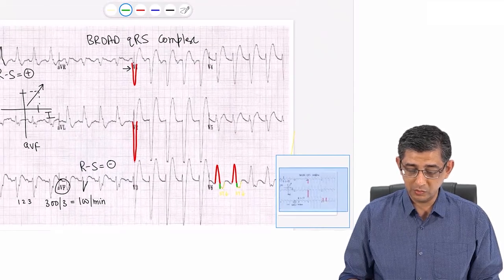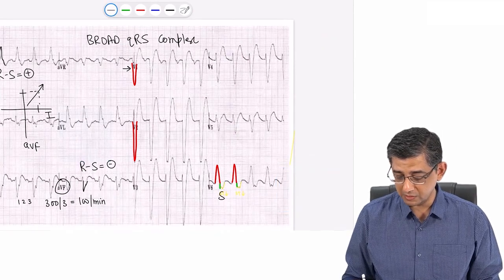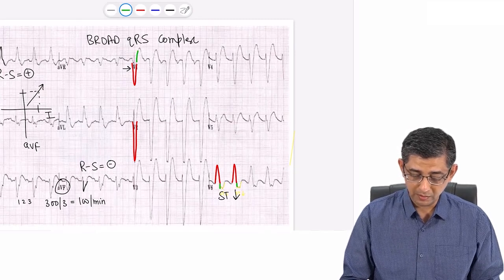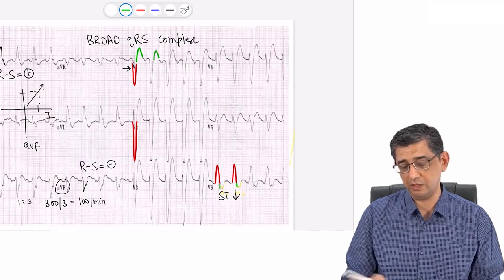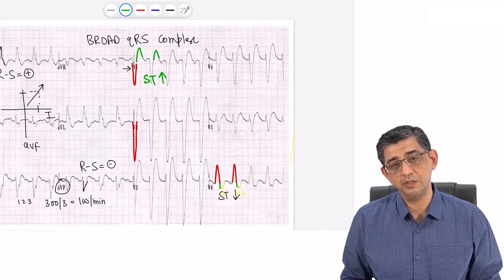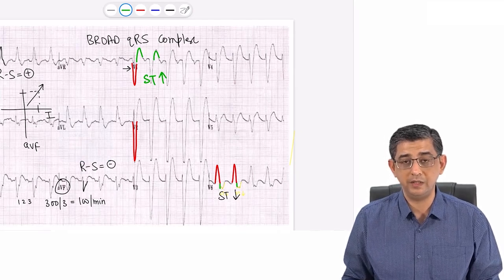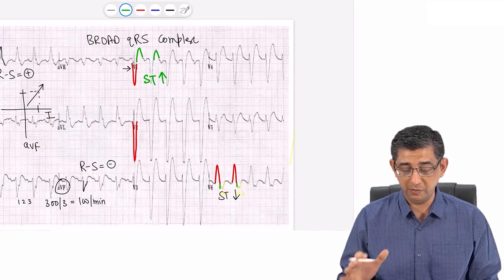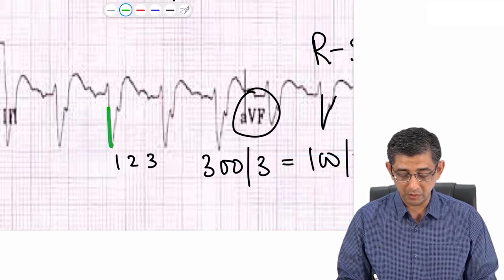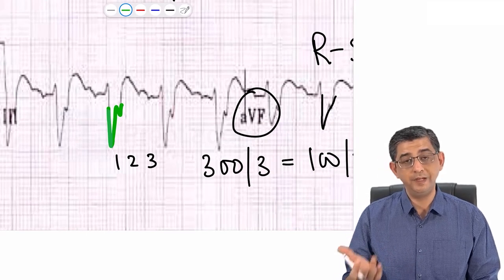I've already sensitized you to this fact and would like to repeat it: this is the ECG where you can have ST depression and ST elevation both present, merging with the T wave anyway. And even if you forget about this, I have shown this ECG mainly to highlight that the M pattern or rabbit ear appearance may not be very distinctive. Though you might notice this rabbit ear, which is relatively asymmetrical, because one ear of the rabbit is very big and one ear is very small in some of the leads.